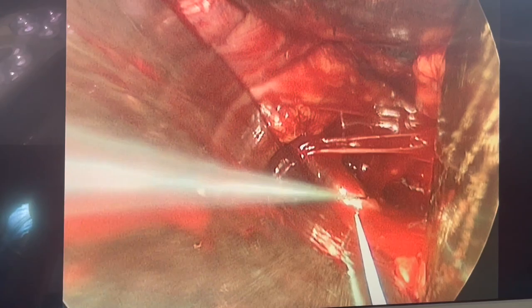The needle on one end of these sutures is then used to fix the sutures to the cervix. We take a thick bite of the cervix without entering the cervical canal.